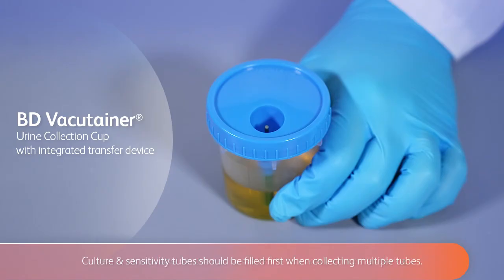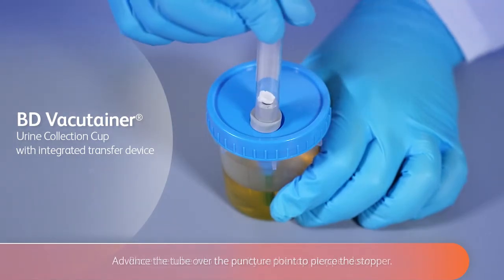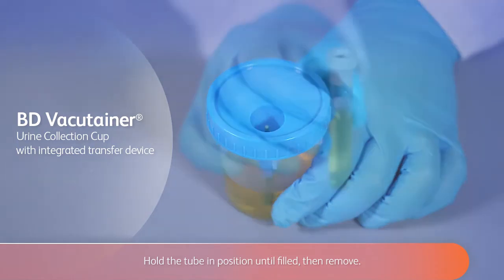Culture and sensitivity tubes should be filled first when collecting multiple tubes. Place the tube into the cavity on the cap, stopper down. Advance the tube over the puncture point to pierce the stopper. Hold the tube in position until filled, then remove.